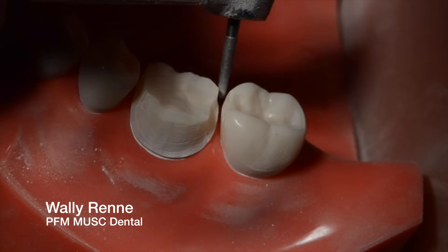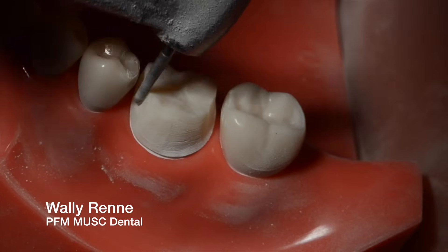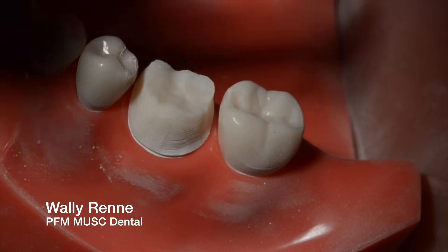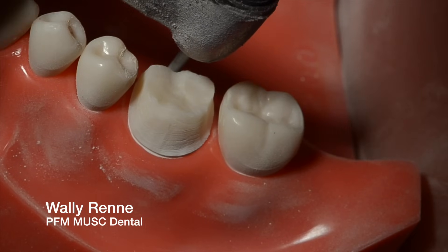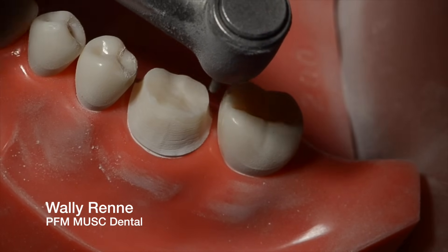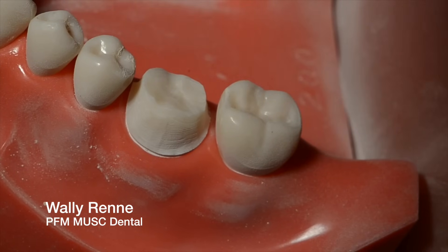With these PFM preps — with gold you were so worried about having a heavy margin on the interproximal — you could keep a pretty heavy margin, about a 1mm chamfer, on these PFM preps until about the line angle of the lingual. Right about there you start to transition to a light chamfer. And you're going to use that same 016 to do the lingual cuts. I'm doing a little light chamfer now on the lingual, and I'm trying to blend that light chamfer in with a heavy chamfer right about the corner line angle of the lingual.